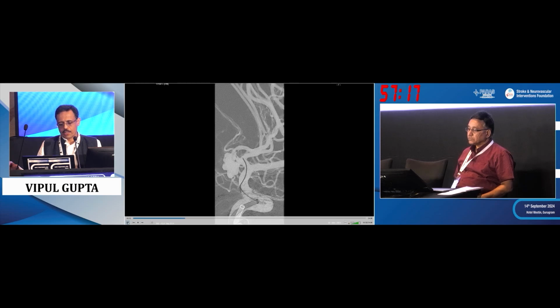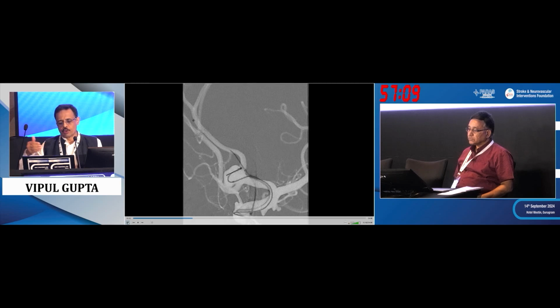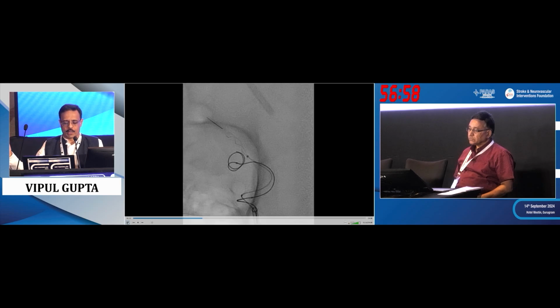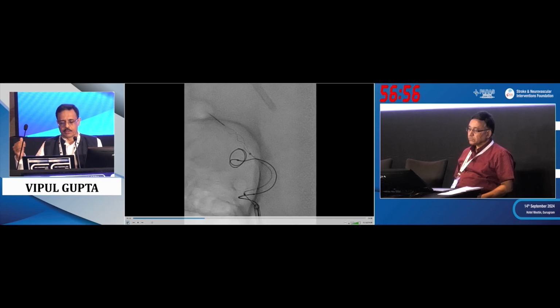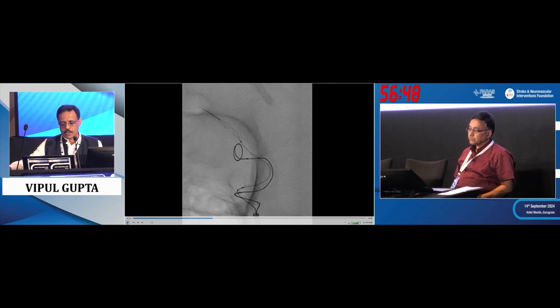In the other plane, we like to see 2 planes, trying to point in the center of the aneurysm so that we can use a long first coil. And sometimes, if it does not form a loop, we withdraw the microcatheter, form a loop, and then push the microcatheter in. And I think we are using Baby Leo. We always force some coil loops in so that if the coiling microcatheter moves during stent delivery, it doesn't rupture. So we always want to use a long first coil to form a great cage. I think that is very important in these patients.